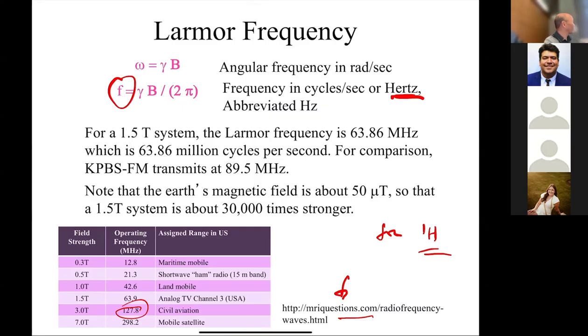Because these are frequencies used by airplanes and radio stations, that's why we have to enclose the magnet in this copper shielded room, to block this interference. So when we're doing the experiment, we're only listening to the energy coming from the sample, not from extraneous sources.